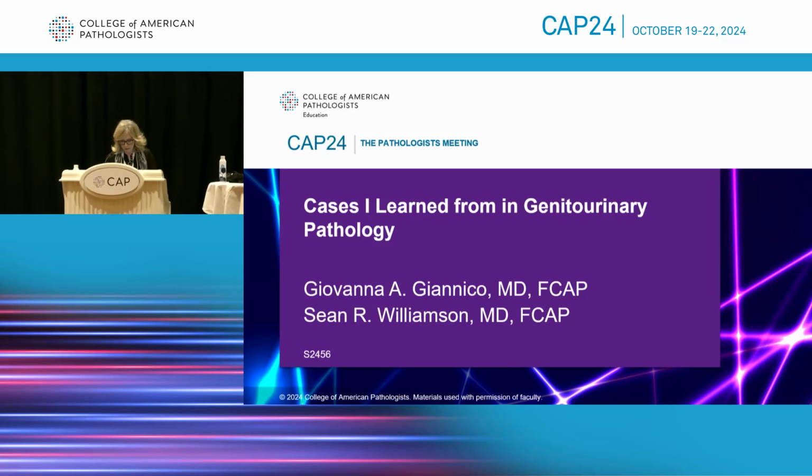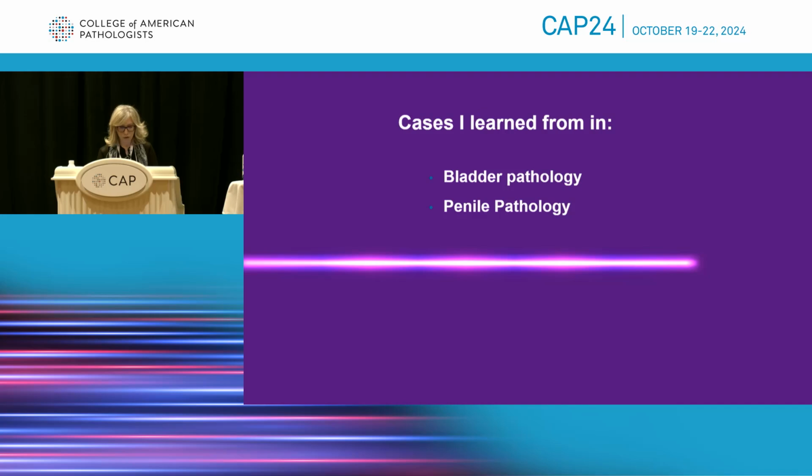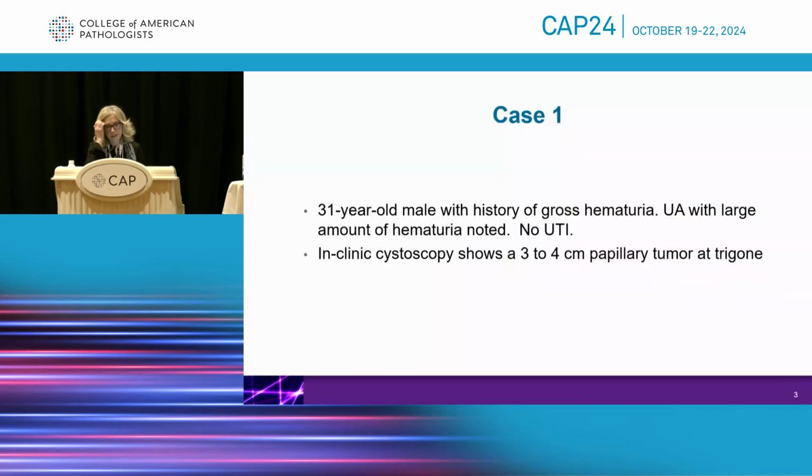These are a few of the cases that I learned. These are actually recent cases that I had this year, and so I wanted to share these with you. I will talk about some cases in bladder pathology, penile pathology. I also have a case in prostate pathology that I have not listed here, but it's actually going to be in here. So this is case one.